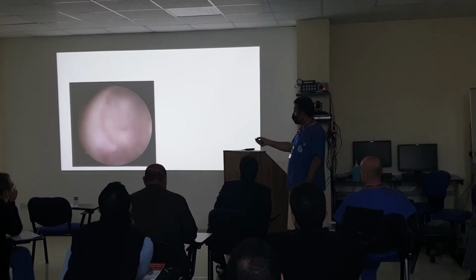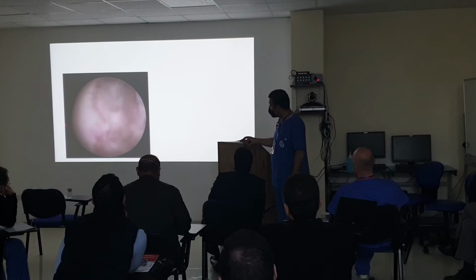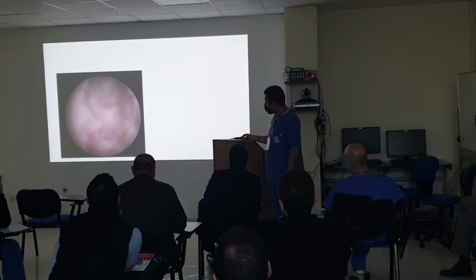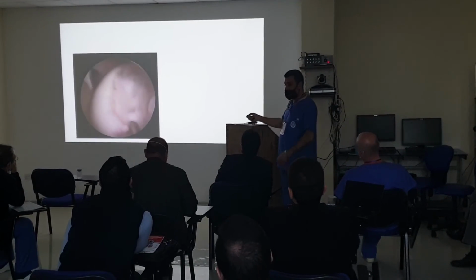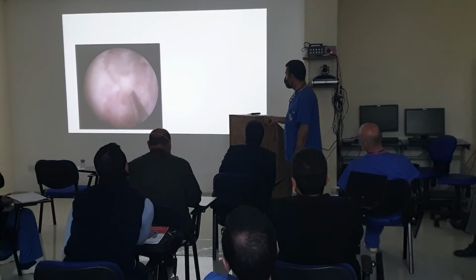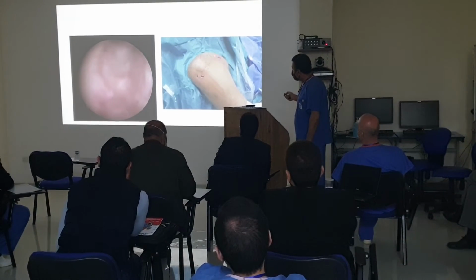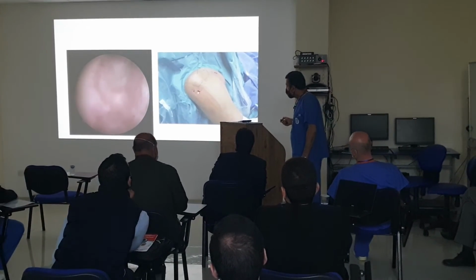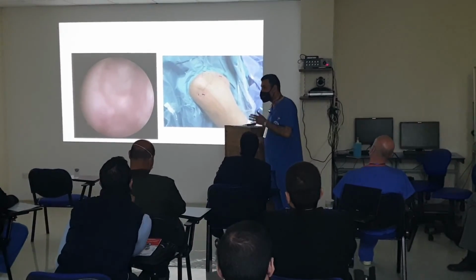So this is another example. This is one of my patients I did for Latarjet. You see how many punctures I did? I'm not comfortable with this. Now I change the needle. Not good, now good. You see? So you have to check with the needle that you are at a good angle. And here you see, I mark my incision here, my portal here, but I did it inferior. I mark my posterolateral here, but I did it a little bit more posterior. So this is according to the needle, the guide by needle.